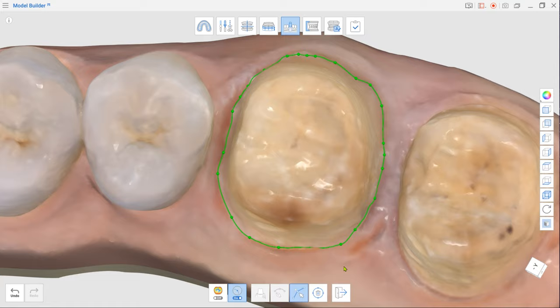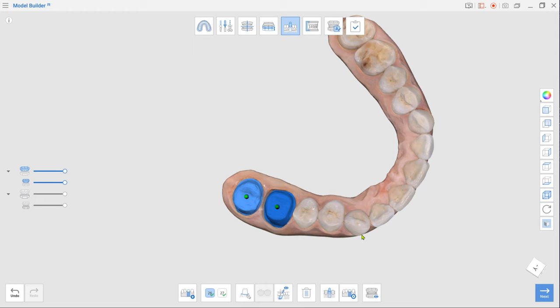Exit when you are done and repeat the process for other teeth. Rotate the model so that your view direction would match the die insertion path and click Set Die Insertion Path from Viewpoint. Repeat this process for each die.